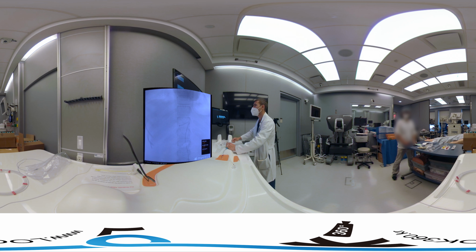Alright, so now it recognizes the wire. Now it recognizes the microcatheter. We're going to take a look with fluoroscopy. You can see both are being introduced. We're getting up into this upward going branch. Now that's the left, and we don't want to select the left. What we want to do is try to select the right hepatic artery because we know that our branch comes off of there. That's the GDA going down. And we're going to try to select something different.